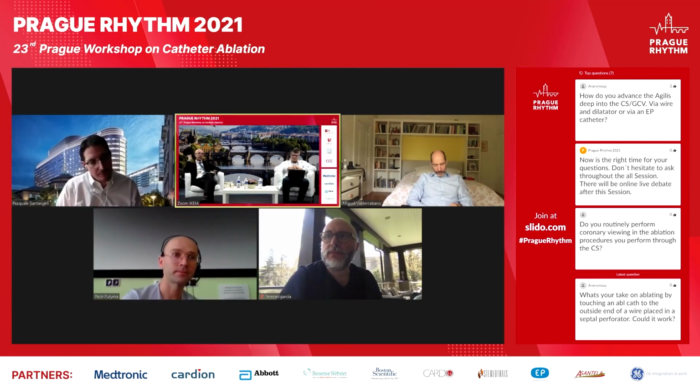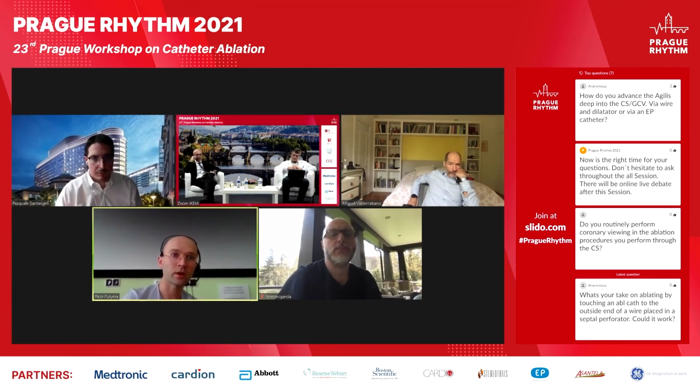You mentioned several indications for bipolar ablation. What about hypertrophic cardiomyopathy, if you want to destroy the septum, if alcohol ablation is not successful? Well, I think we are quite far away regarding catheter design at this point, but I'm pretty sure that once we get a larger surface area of the catheter, then perhaps we will be able to perform septal bipolar ablation in hypertrophic patients.